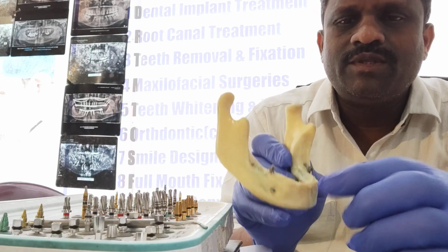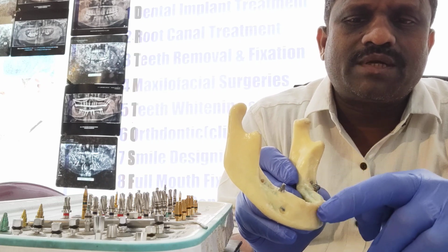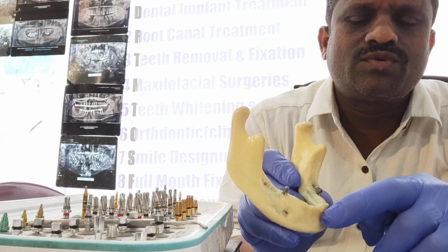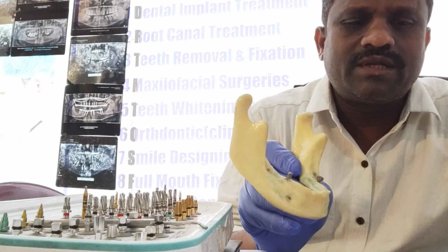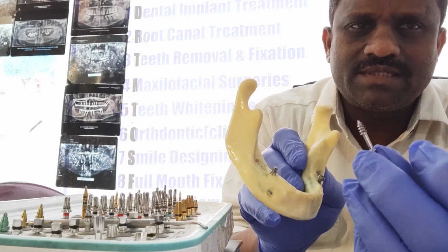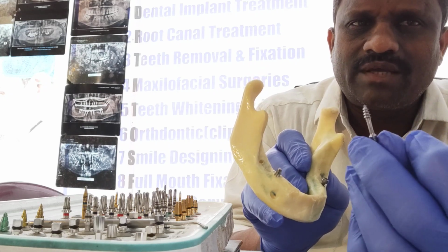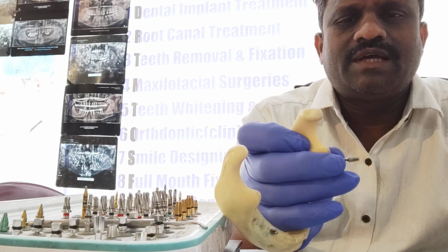So always your osteotomy should start from lingual to buccal, a little from the lingual aspect of the ridge towards the buccal aspect. So you have to follow the osteotomy drill pattern, how you have done the osteotomy. So I will place one. This is not the lengthier one, I think a 16 or 17 mm bicortical screw. I'll place this one now with the help of the driver.